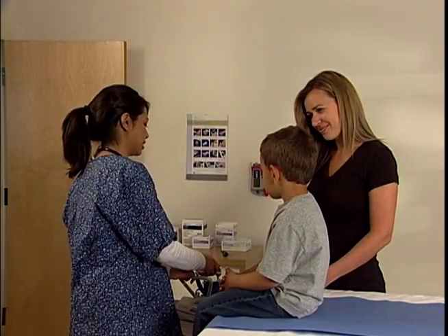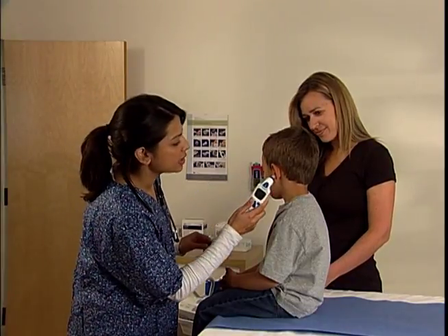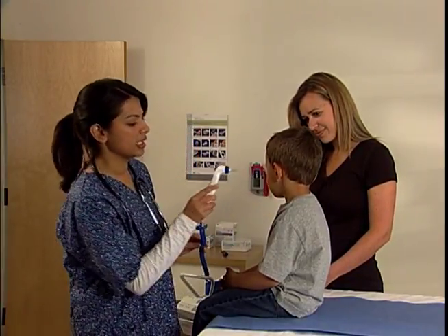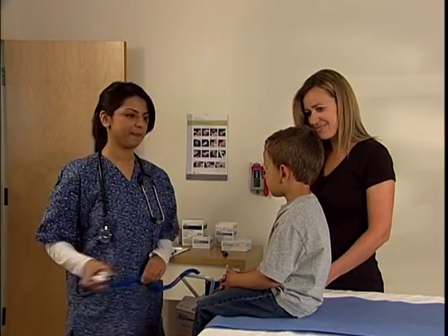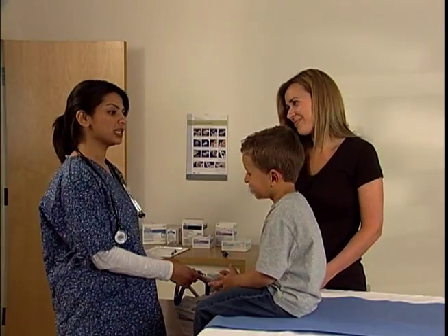The Genius 2 is fast and accurate. During temperature assessment, it will take 36 to 360 measurements and select the highest reading. This is called the peak select system, and the Genius 2 is the only thermometer on the market today with this patented feature to enhance accuracy.